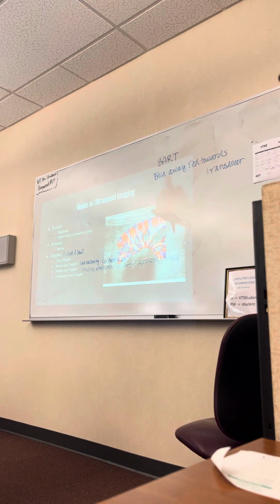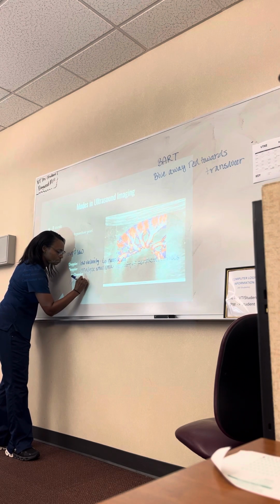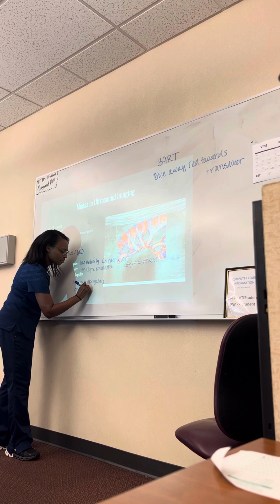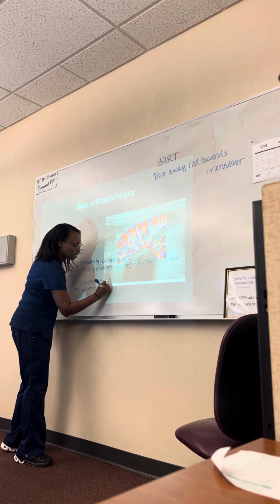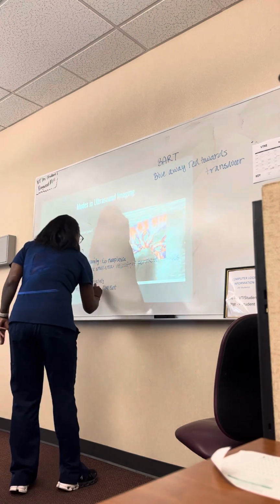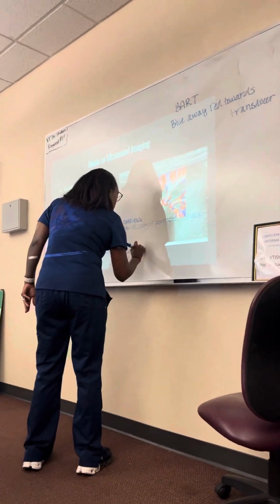And then lastly, the continuous wave Doppler. This is going to use two different sets of crystals. One set is going to receive, and the other set is going to emit. One set receives the signal, and the other set sends out the signal.